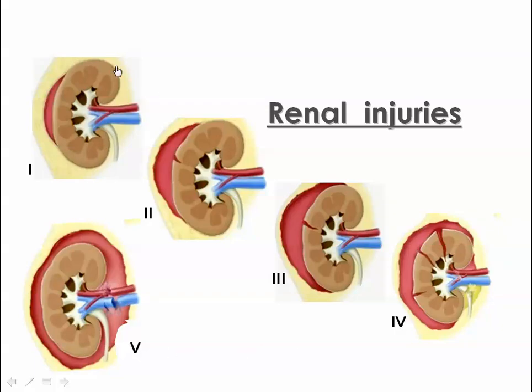And here is the classification, or the grading, of renal injuries.